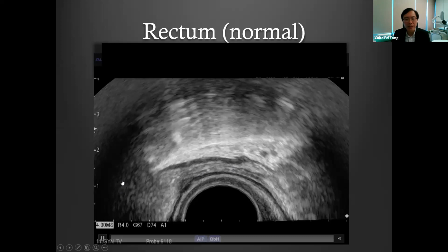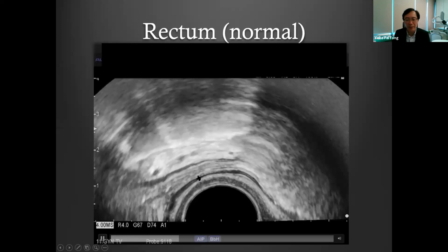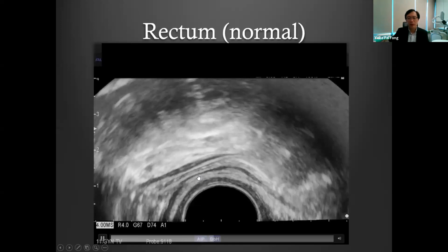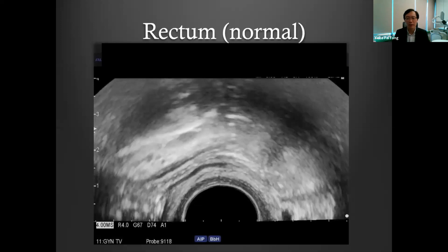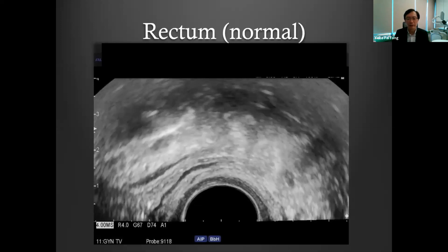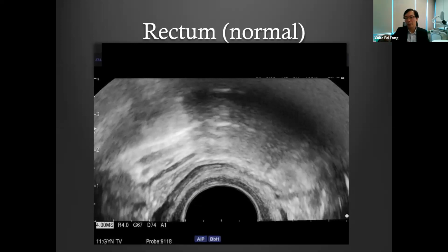So I'm just going to play this video over here, right? So you can see I'm tracing it upwards. I'm going up, right? I'm slowly going up here, right? So far the rectum looks very normal, okay? It is free, okay? So you notice the rectum has changed from this way to actually this way because I'm actually moving my probe upwards already.